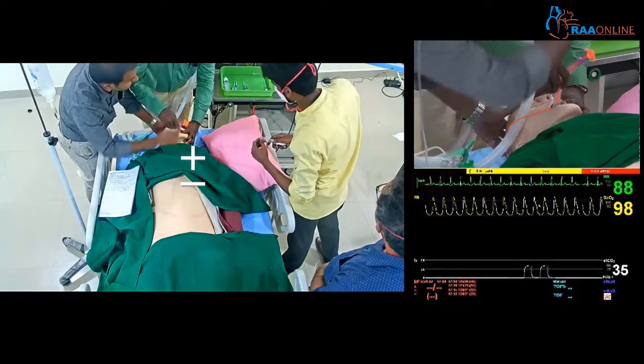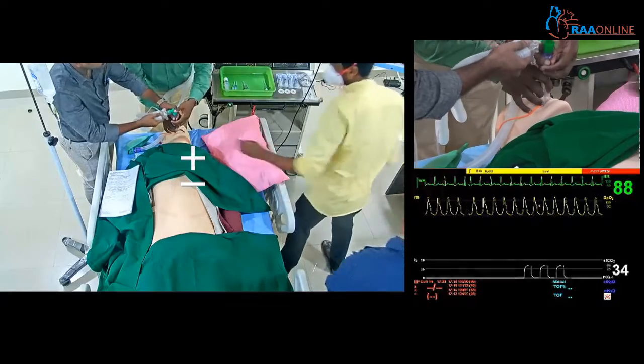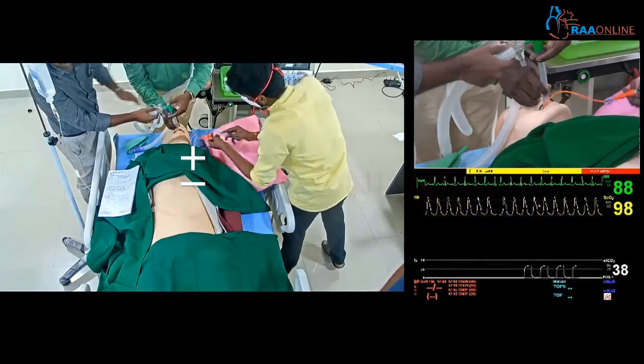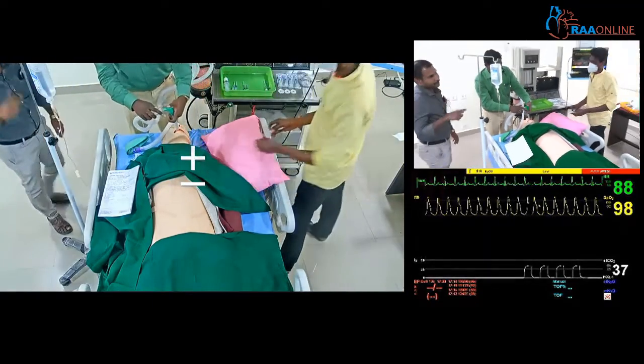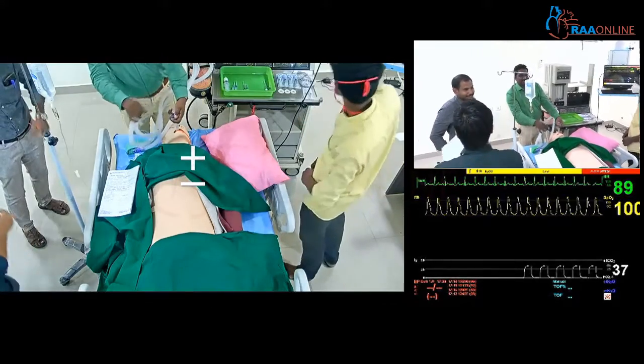It's not going in. So the ETCO2 came. We assume that we have inserted the LMA. Okay, sir. ETCO2 arrived. Thank you. Now we have done a mistake. What we have done is we have to follow modified RSI sequence because the patient's status is not known.